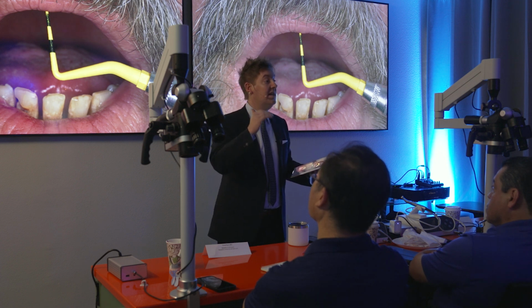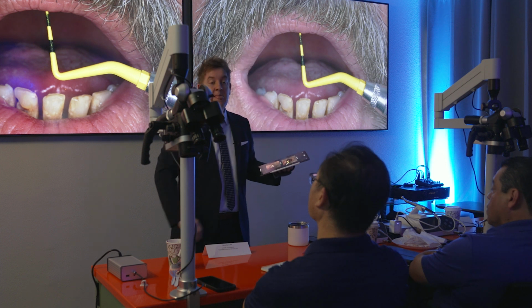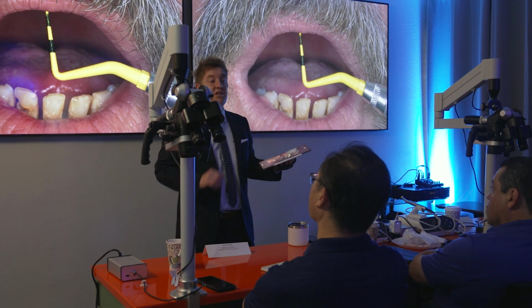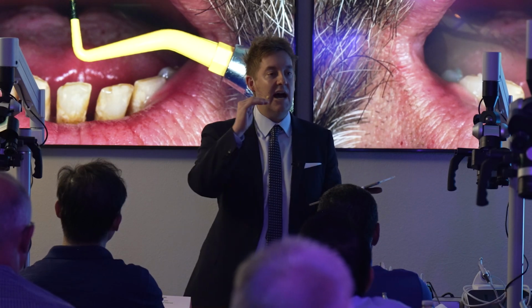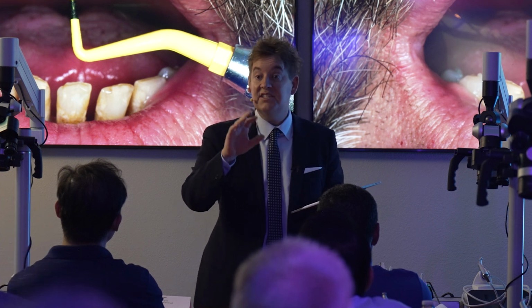And so when they're not showing anything at all, here would be my instructions to Mark. Mark, I'd like you to lick your lips, relax, let your lips touch, but don't let your back teeth touch, and then just let your mandible hang like this. And I want to see how much of his maxillary central incisal edge position relative to face shows.